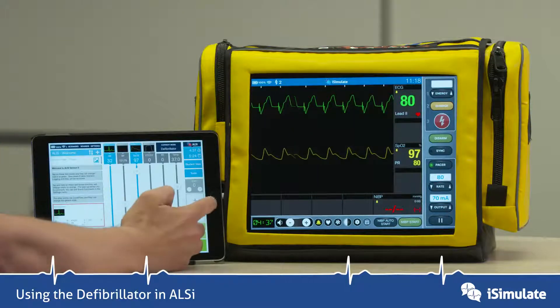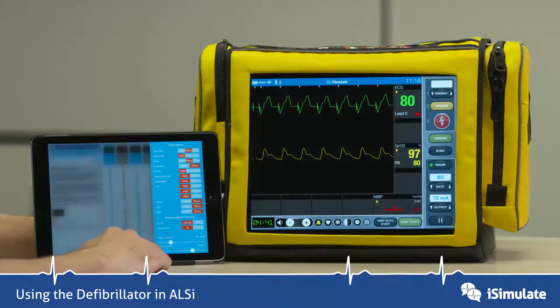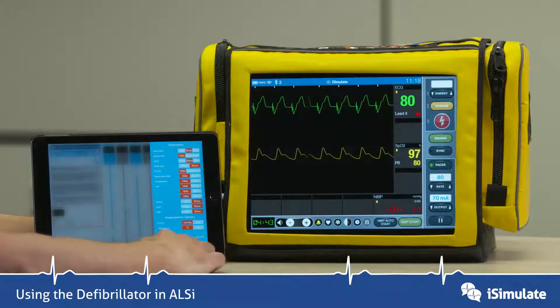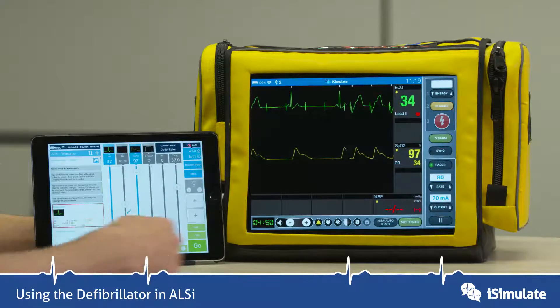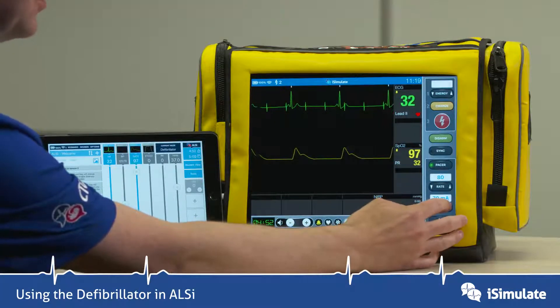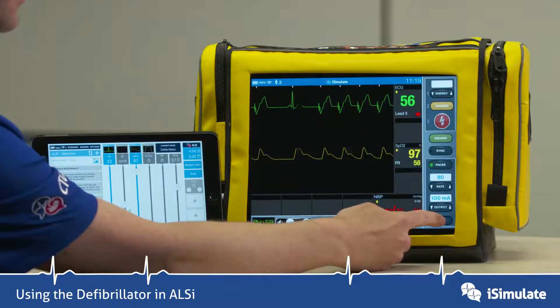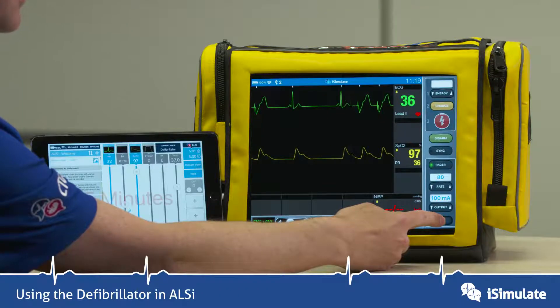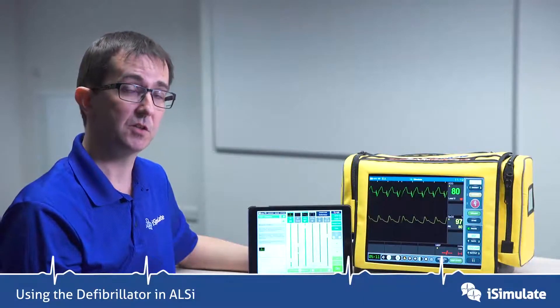To alter that, you go into options where you can alter the pace threshold — it was at 50. If I increase it up to 90, you can see we've now lost capture, so what you'd have to do is increase the output to go above 90. If you press and hold the pause button, you can see the underlying rhythm. And that's a basic overview of many of the defib functions that we have.